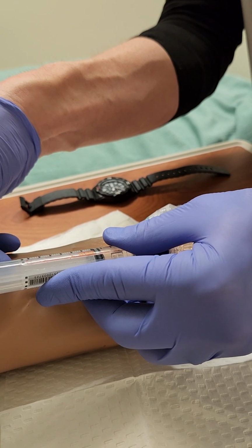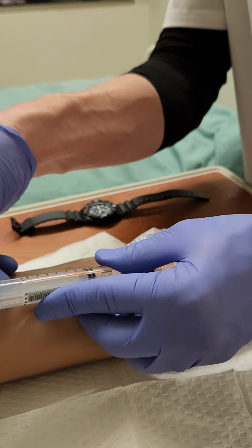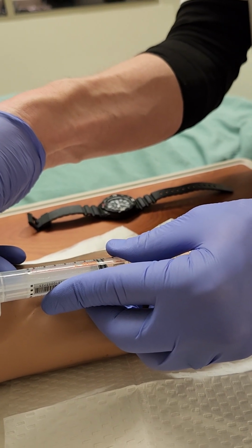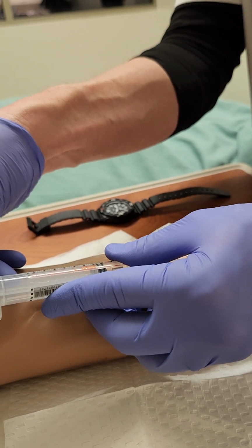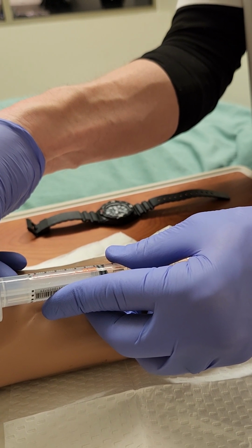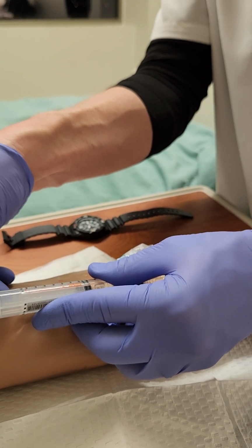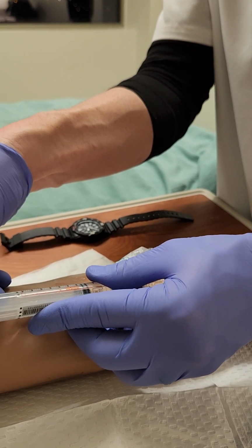All right. I think we're almost there. We got like 15 seconds left. You're rocking this. Good job. Never thought your rubber arm could have taken so much stuff. All right, there it is.